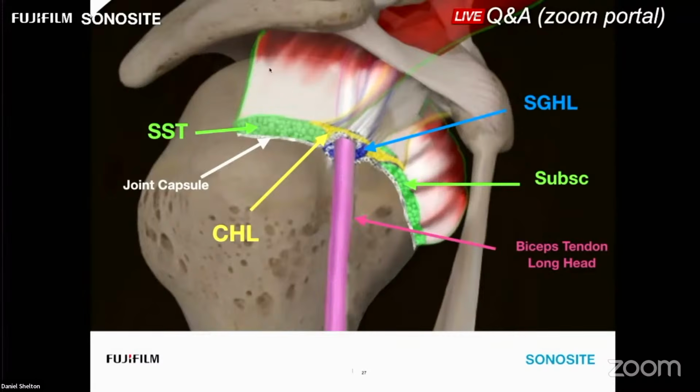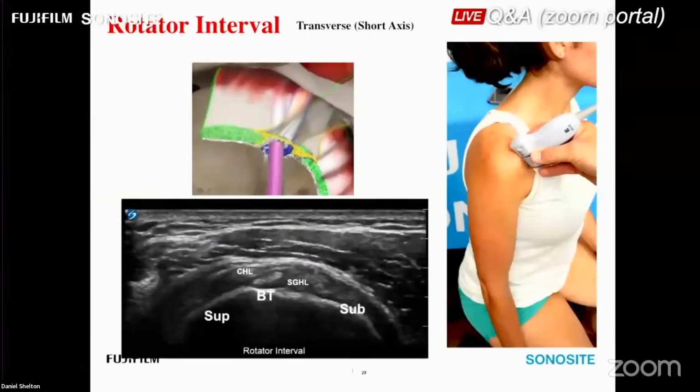If you have a large joint effusion of the glenohumeral joint, it's right here at this window that it will outpour into the biceps sheath. So if you see a huge effusion in the biceps sheath, you can almost 100%, I think it's 90-something% by Jacobson, rely on there being some sort of rotator cuff tear that let fluid out into that articulation of the biceps. Let's take a look at how that images.